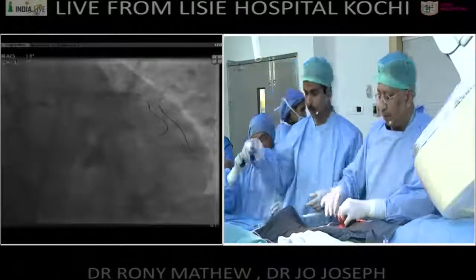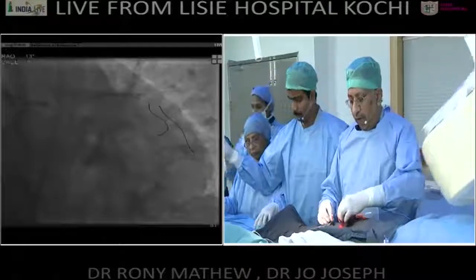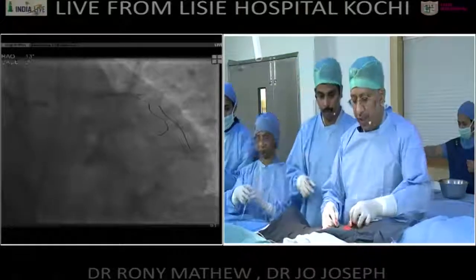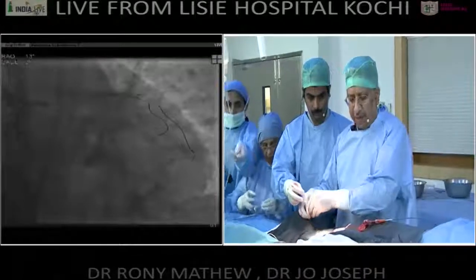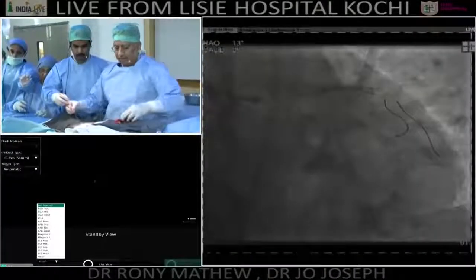Give me OCT run. OCT, please. Right, so now I will do an OCT in front of you so that we see the actual run and you can see how we do an OCT also. It doesn't take much time getting an OCT done.